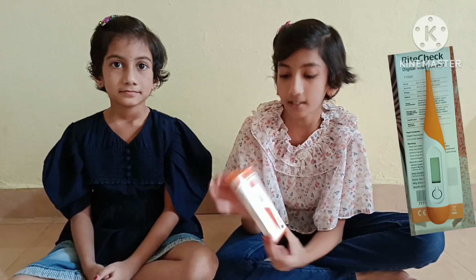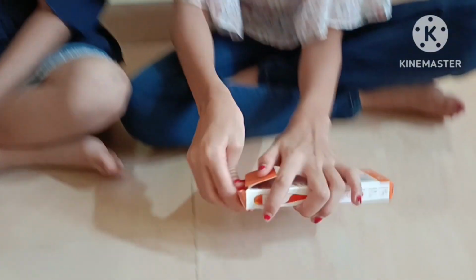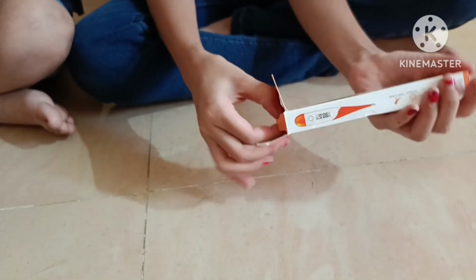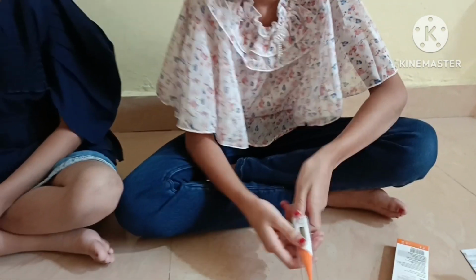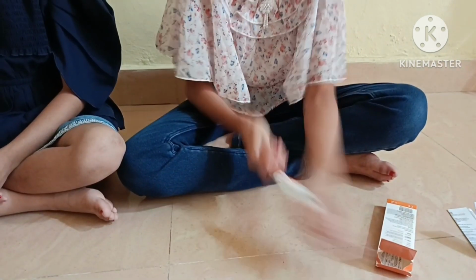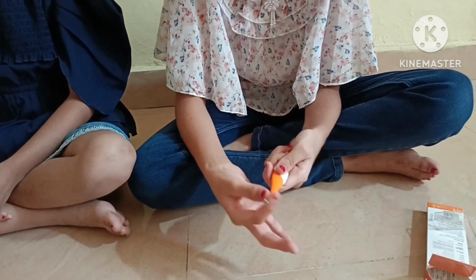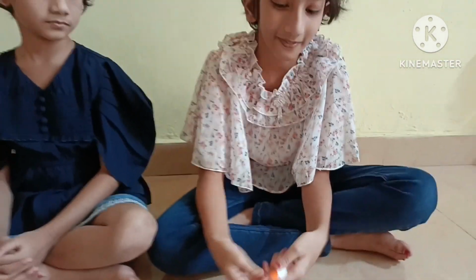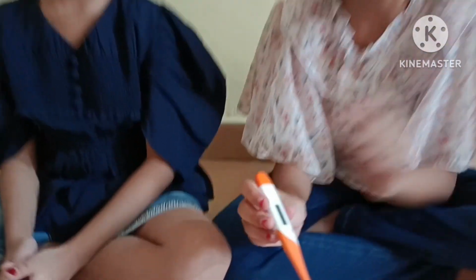Digital thermometer. I'm going to open and show you. This is flexible. The normal temperature is 96.8 to 98.6. This is on-off button.